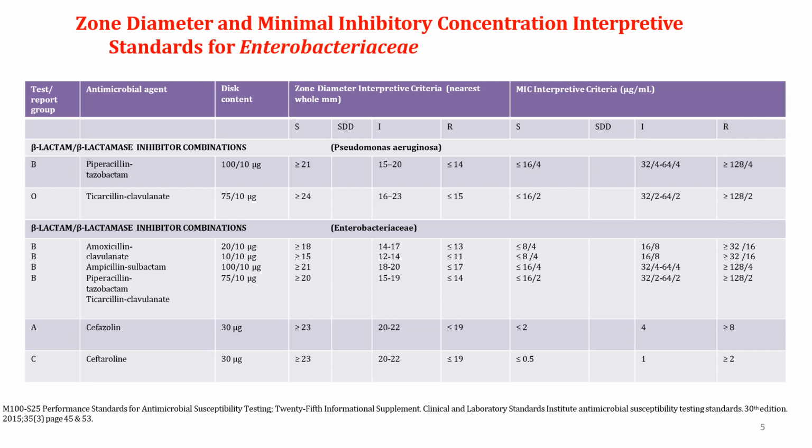Again, this breakpoint differs from organism to organism and from sample to sample. For example, Streptococcus isolated from a CSF sample will have different breakpoints from a non-CSF sample. So when we get microbiology reports of such samples or such organisms, see the breakpoints, particularly whether it is of CSF or non-CSF.